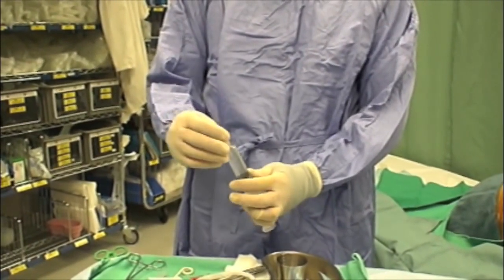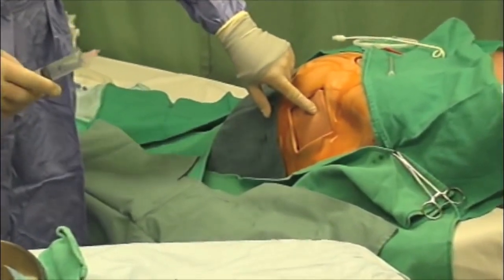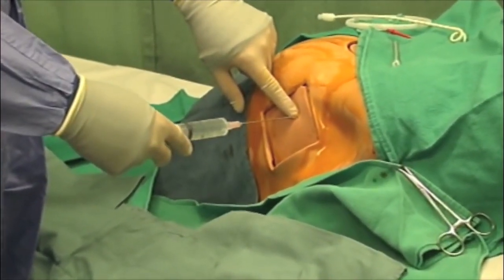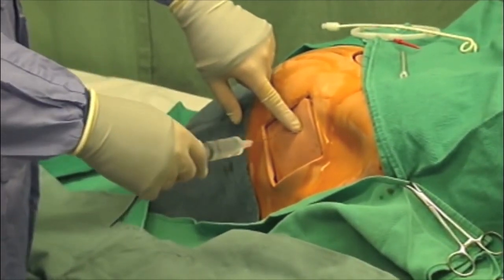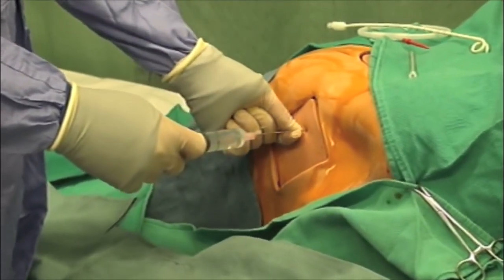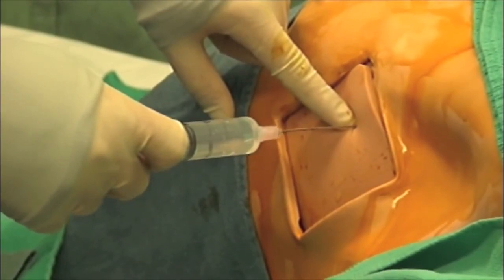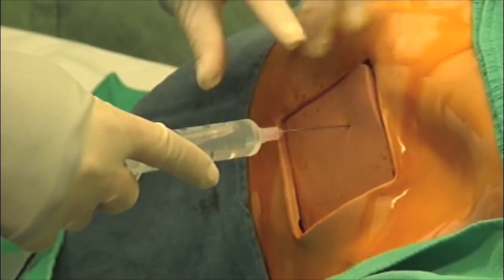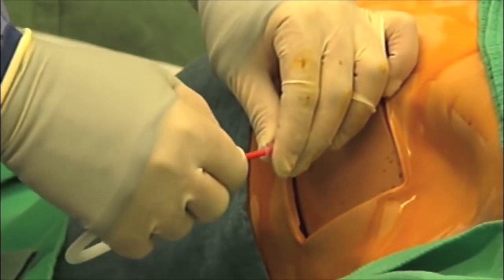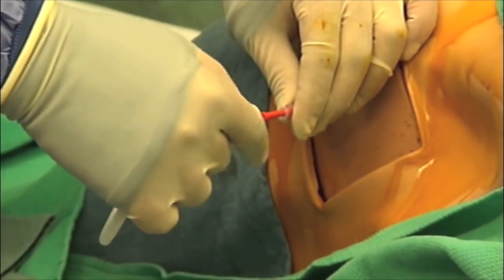Attach the needle to a syringe containing lidocaine or normal saline. Insert the needle toward the pleural space until air is aspirated into the syringe. Holding the needle securely in place, remove the syringe. Insert the guide wire through the needle and into the pleural space.